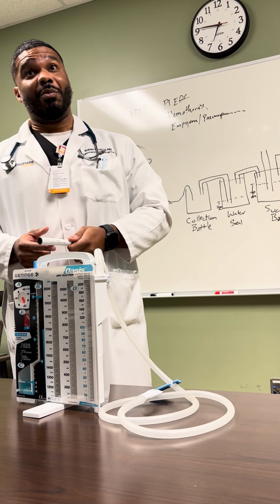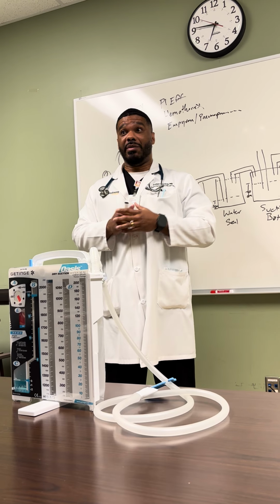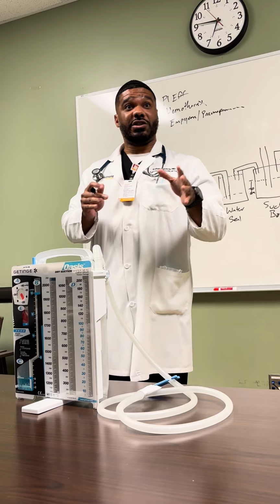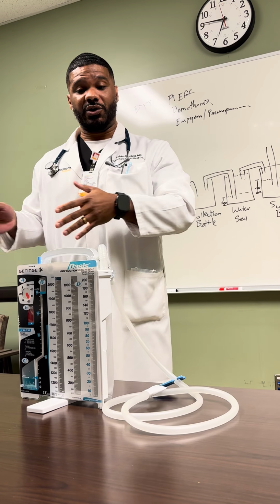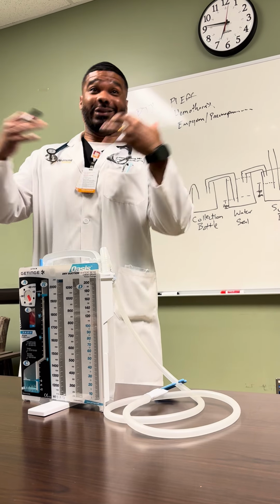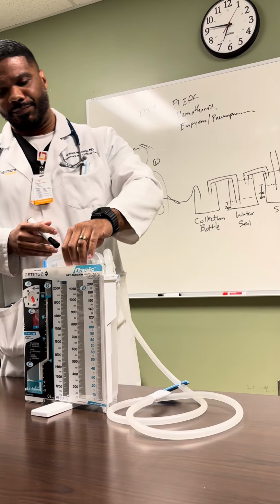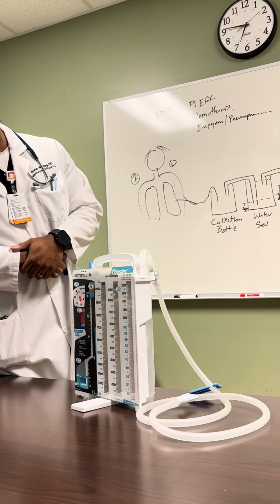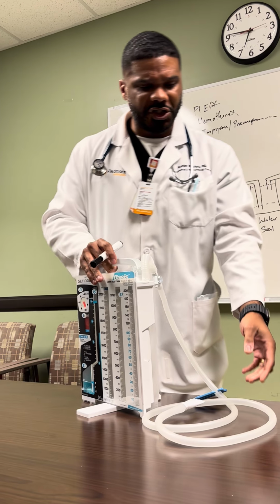So when you assess your patient, if you walk into the room and the patient's giving you thumbs up, talking, conversive, no issues and all that, chances are we're not having any major issues, okay? But you still want to continue your assessment. If you walk into the room and the patient's grabbing at their chest and tachypneic and everything, then you want to make sure that you troubleshoot your chest tube and make sure that it's not an issue with the chest tube. But you start with the patient looking good, and then you kind of trace down, right?